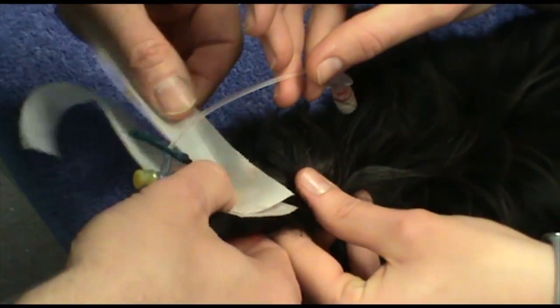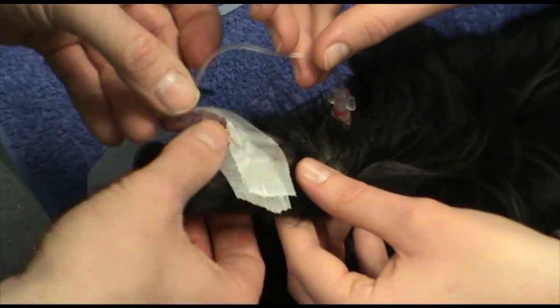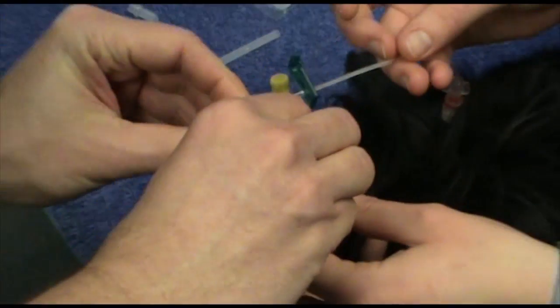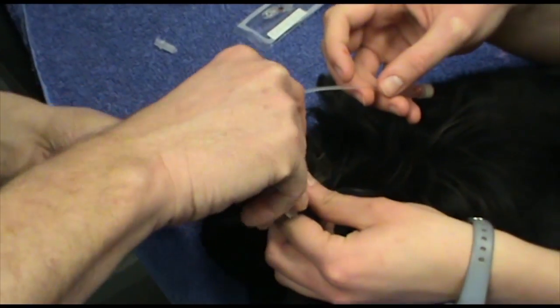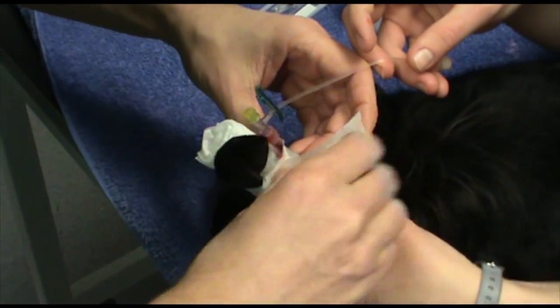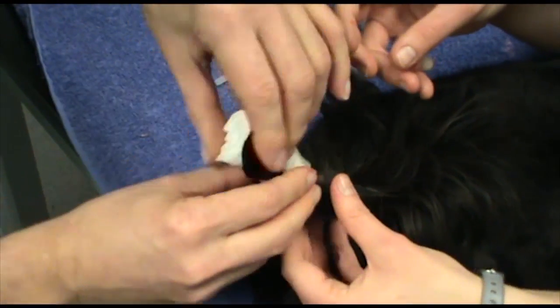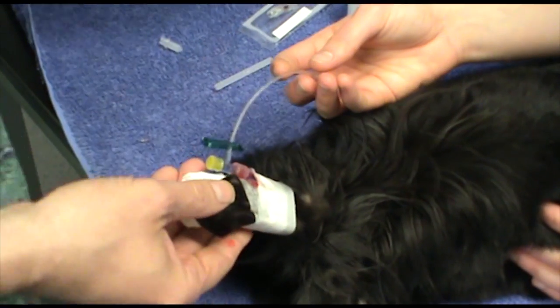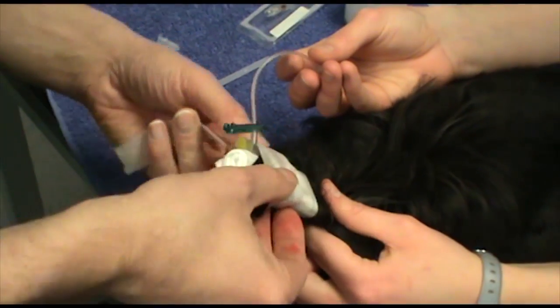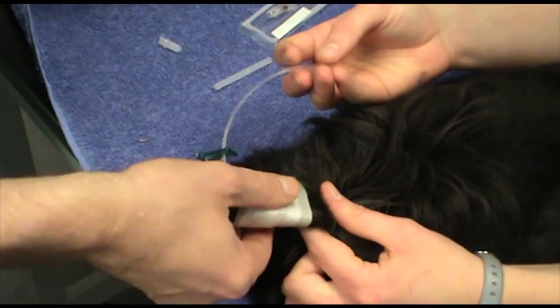We're using sticky but not very sticky tape so we can remove it without ripping the skin. This is basically going to be inserted now just to hold the catheter — it's just a couple of swabs rolled round and taped together. We're just rolling the tape round and that gives us that curve so everything's held nicely in place. Obviously the rabbit here is so floppy we can't secure it easily without that, and it also stops the catheter bending and helps to keep it straight.